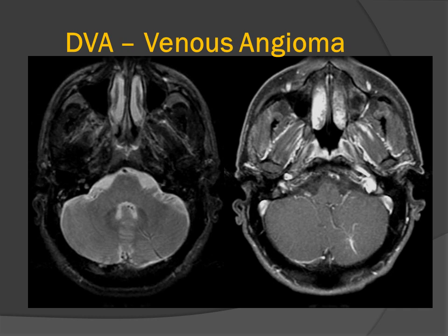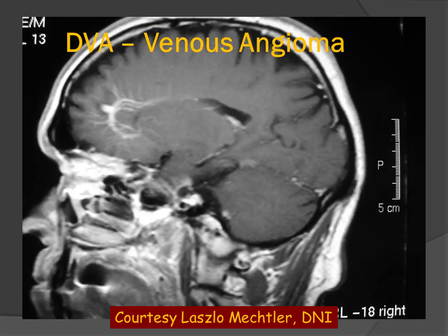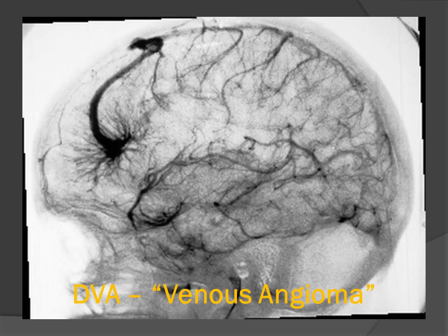Here is another example of a posterior fossa developmental venous angioma. We have the caput medusa of the multiple small collector veins and the dominant transcortical trunk or transmantal vein. Here is another right frontal lobe DVA. We can see the small collector veins and the dominant transcortical trunk, and in the sagittal image, the unique anatomy of multiple small veins collecting onto larger veins, which connect to the dominant transcortical or transmantal trunk.